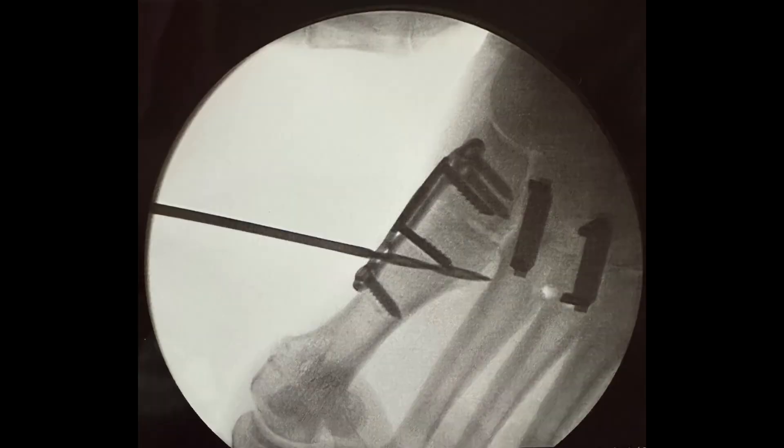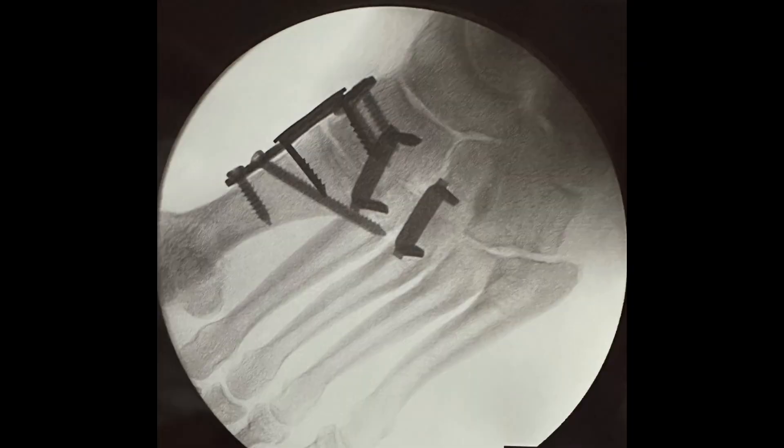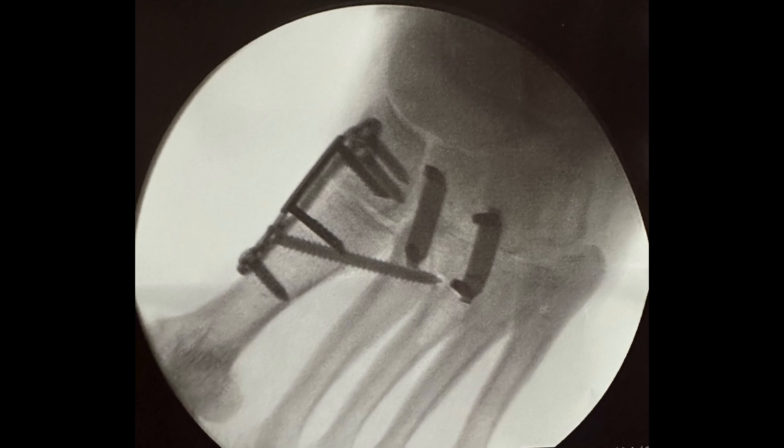A screw is then applied across the first and second metatarsal bases using fluoroscopy. Final fluoroscopy shows satisfactory reduction and implant positioning.